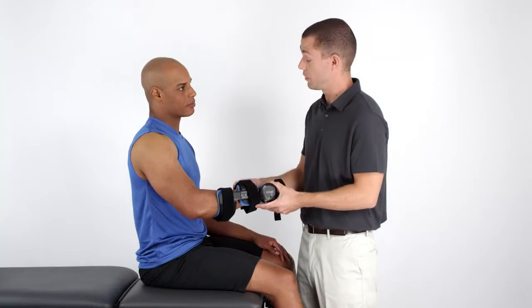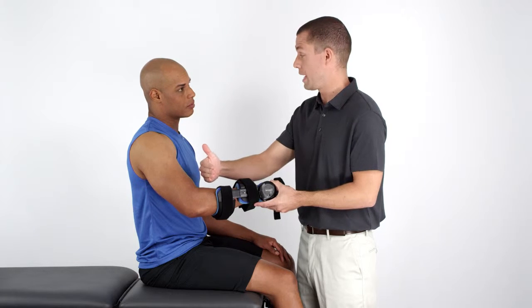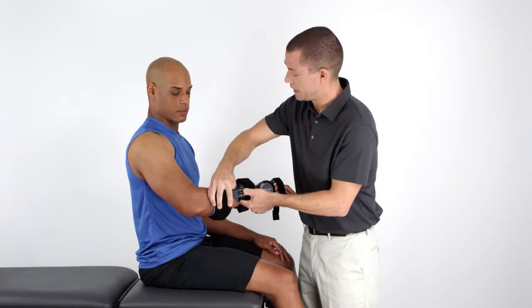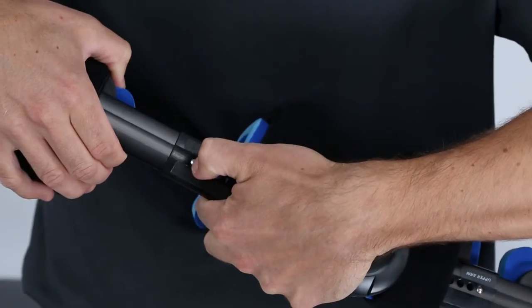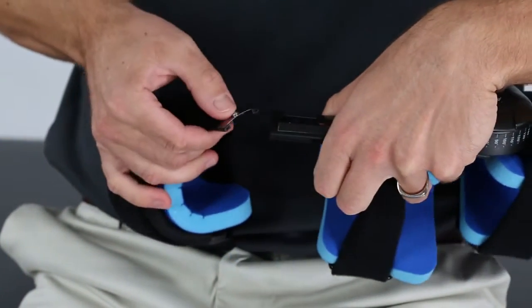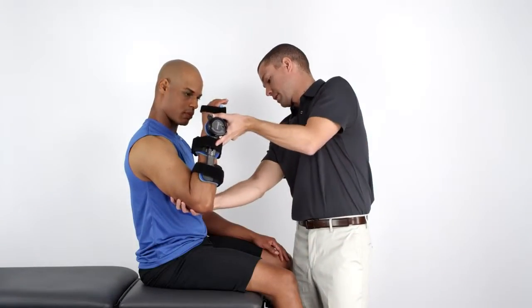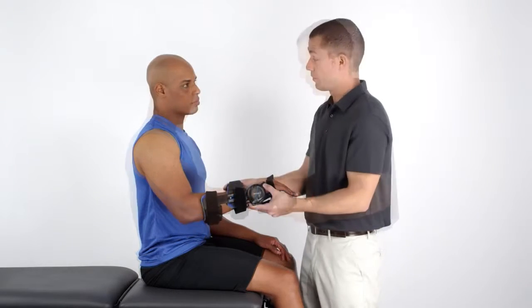The orthosis features a unique strut length adjustment capability to assure a comfortable fit. Depress the leaf pin on the strut and increase or decrease the length as needed. Note that extending the strut length beyond the last adjustment hole may cause the leaf pin to fall out of the strut. If this happens, reinsert the leaf pin into the housing and reconnect the two struts. The strut should be adjusted so that the proximal cuff does not restrict elbow motion.